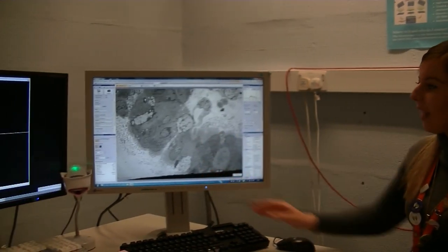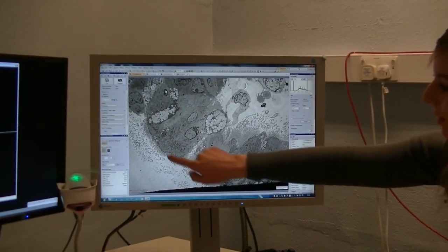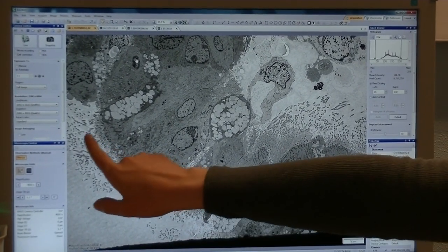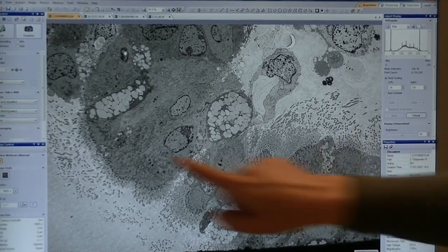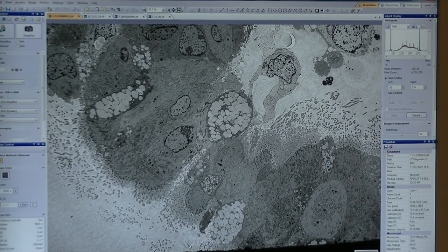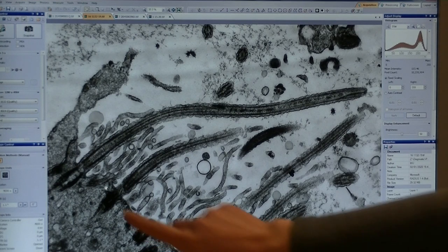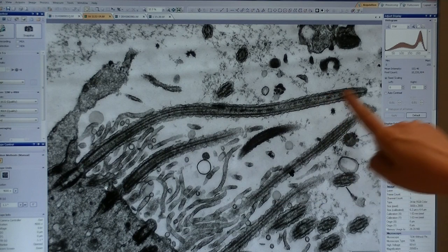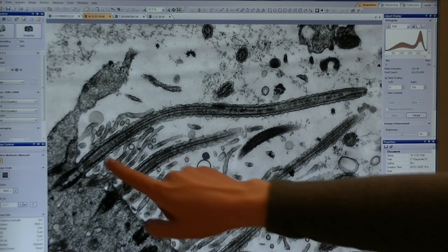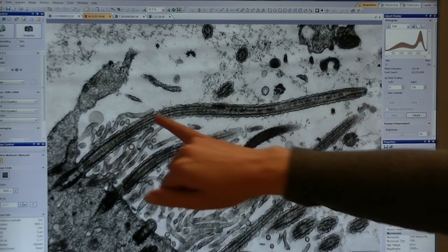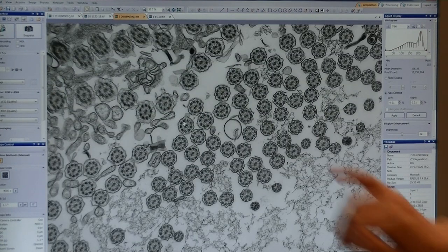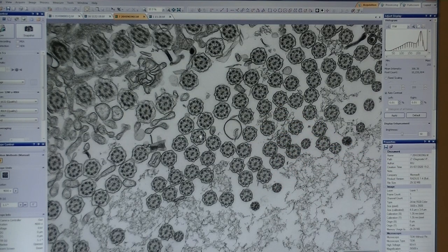Over here we have some nice epithelial cells, which are the cells which line your airways, and on them are some cilia — these little tiny dotty things. They are hair-like structures, so this is one cut longitudinally along the length of the cilium, and we can see it's long and it's got these black bits in it. The black things are tubules, and they're what we are interested in. If we cut this the other way as a cross-section, we can see that they have a really nice, regular, uniform structure.